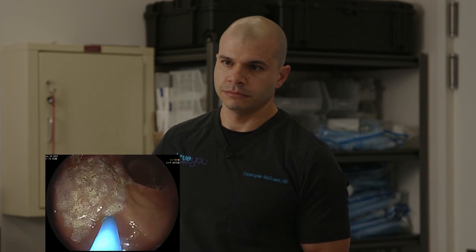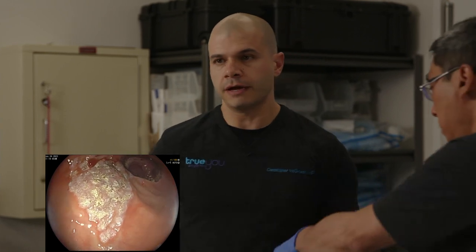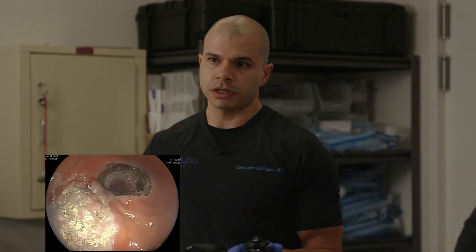Anne from Facebook wants to know, do you feel a burning when you're healing from this process? In terms of healing and recovery, because we're working endoscopically, the symptoms are quite mild. Patients will vary in their response to this. We're finished with that. We're going to switch scopes real quick. This is a single-channel endoscope. We're going to switch to a dual-channel endoscope so we can suture.